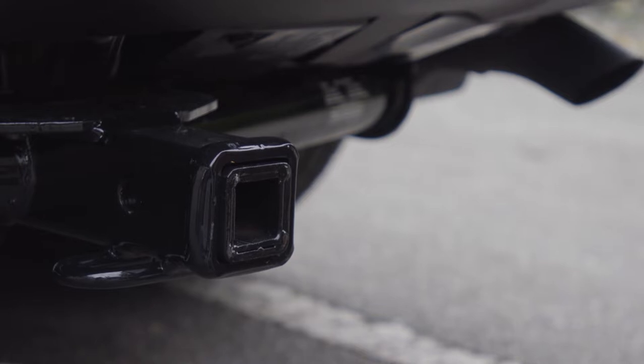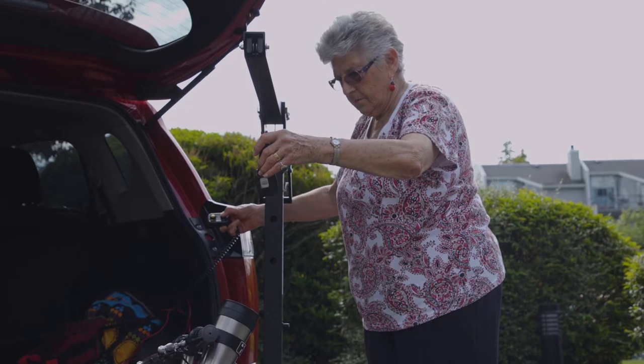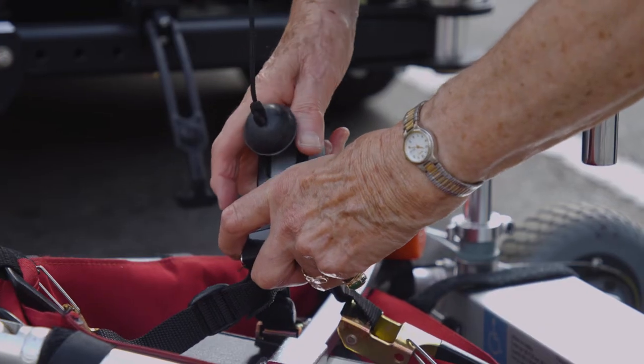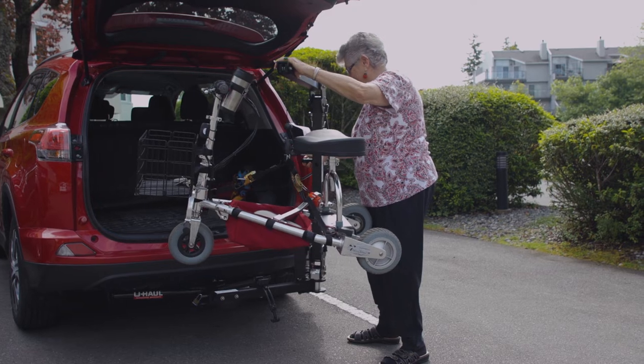The Hitch Lift is easy to install and attaches to the trailer hitch of most vehicles. To get her scooter into the vehicle, Wenda simply secures the lift cable to the device, pushes a button and gently guides it into place.